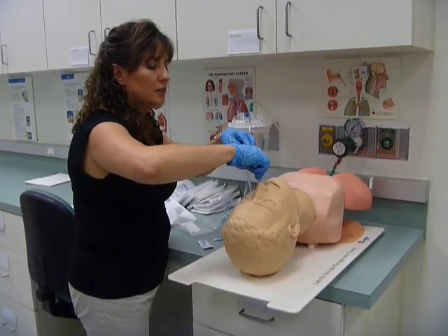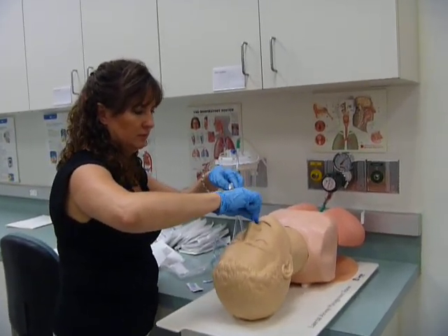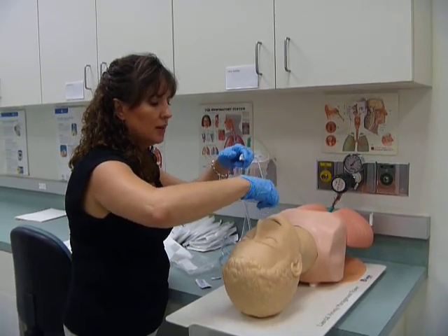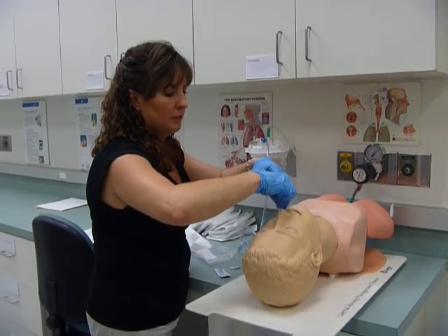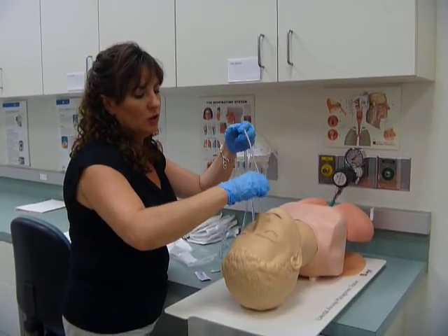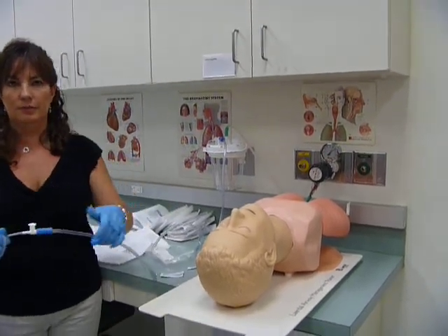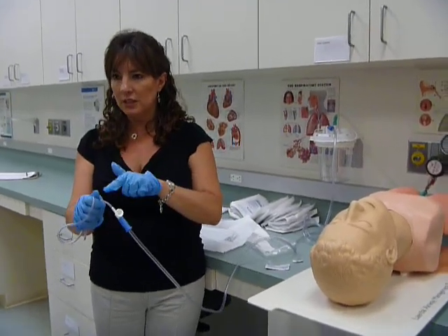So I'm going to advance it until I feel like, in him, I think he's okay. And I suction all the way back. Okay, so you're going to suction a few times, always keeping this hand sterile.